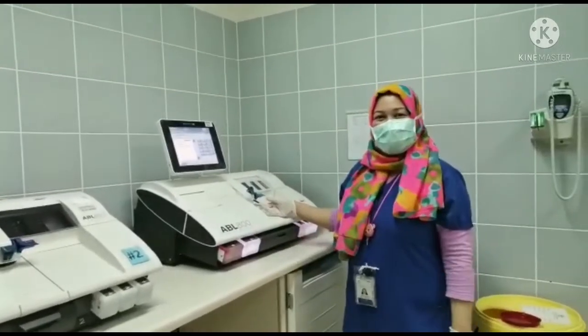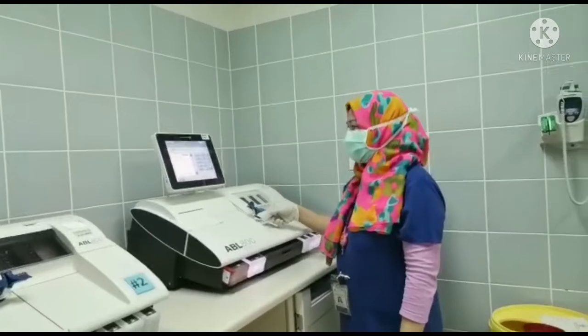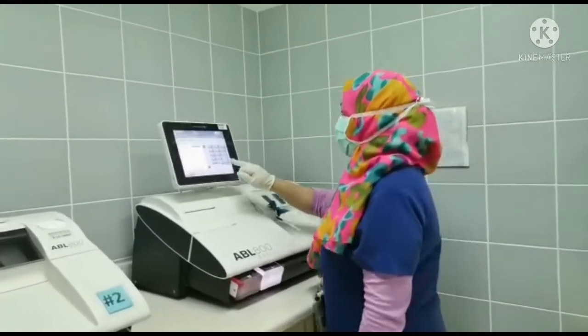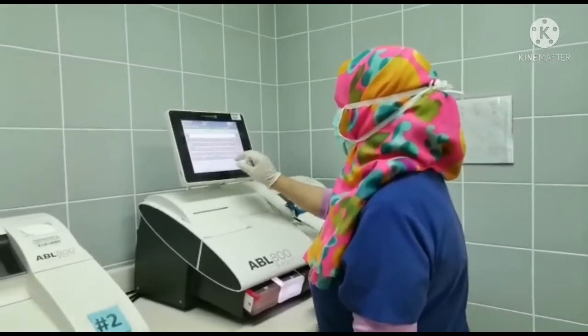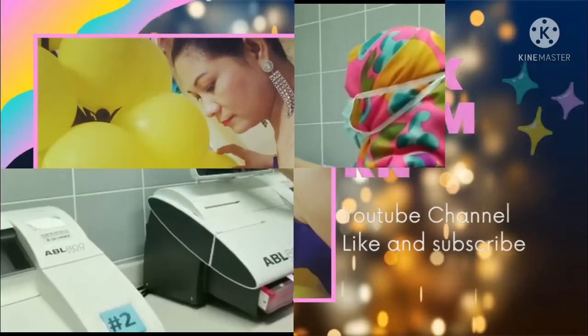So this is how we are going to do the blood gas, guys. You have to fill the sample here and it will aspirate. And you have to enter the patient's ID. For example, I don't know.